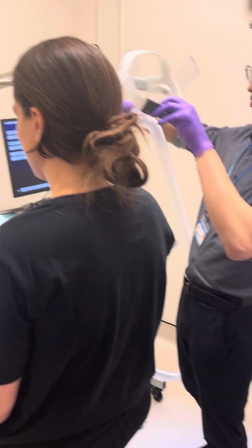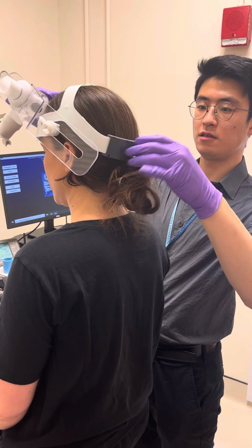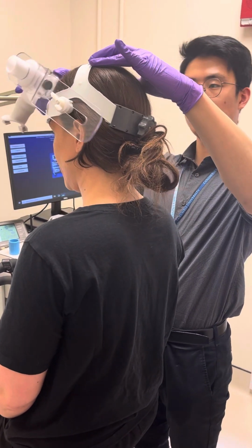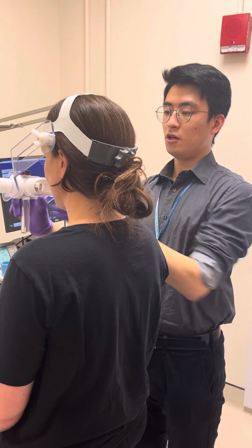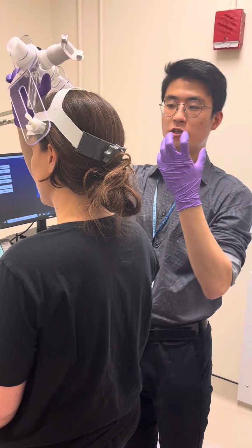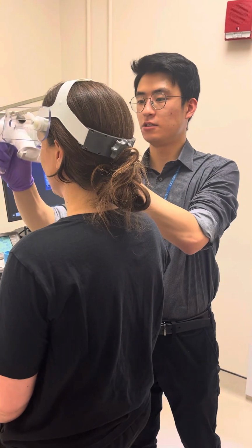All right. So you want to make sure that this isn't poking them in the face. So headgear goes on, and just tighten. You want to make sure that it's snug, and then that you can adjust this, right? The subject is going to bite down on these two pieces and then close their lips all the way around it. Usually the best way to do it is to get it all the way in first, have them close their lips, and then bite down on the two pieces.